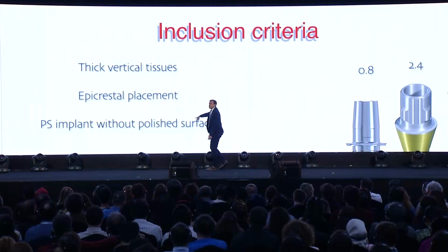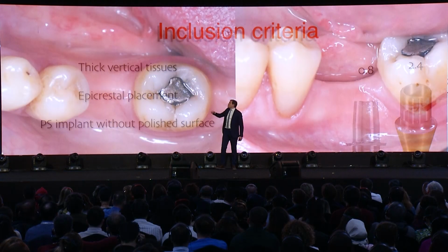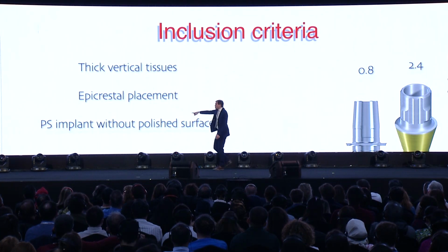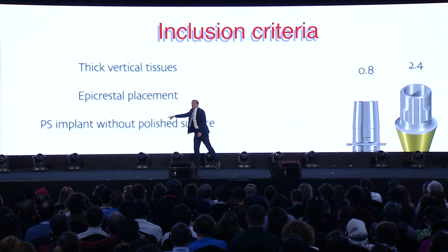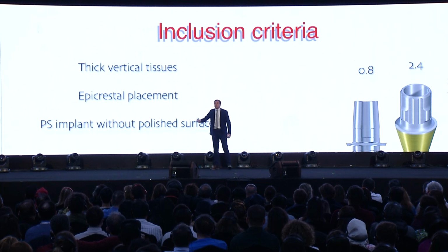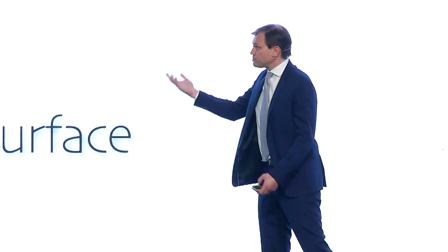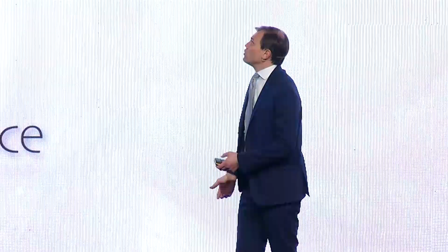And of course, I'm selecting the implant which is good for zero bone loss concepts because it really has all the features which we talked about. Platform switching, no polished surface. And in this case, we were using NucleOSS.